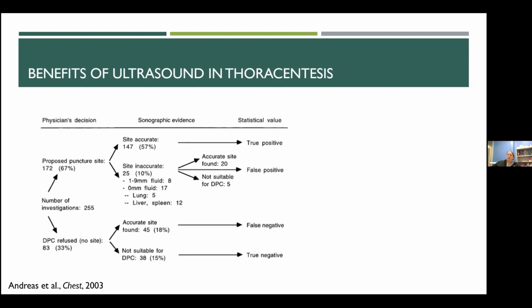So how does ultrasound help? If this is a procedure that most people perform without ultrasound, why would we add ultrasound to the mix? I think there's always people who, just like with arterial lines or central lines, say, I've done it for years, why would I use this new technology? Well, this is a study from 2003. It was in Chest, and it compared the choice of sites from regular physician landmark-based choice with looking at that with ultrasonography, and then determining if that site was accurate or not.